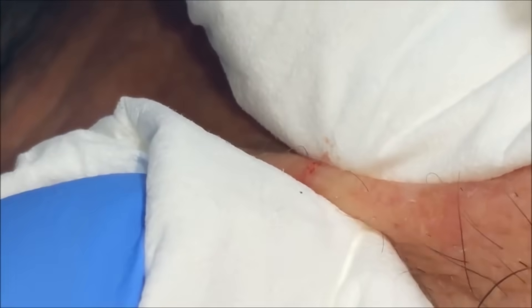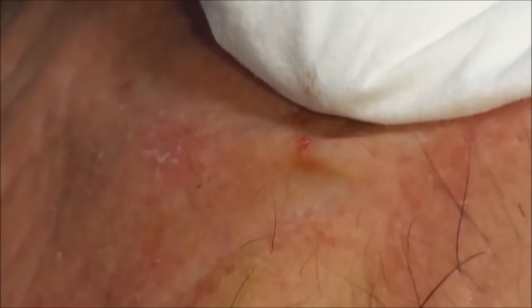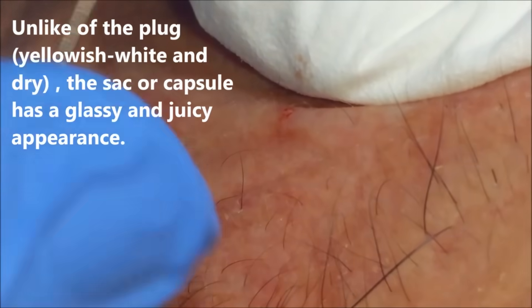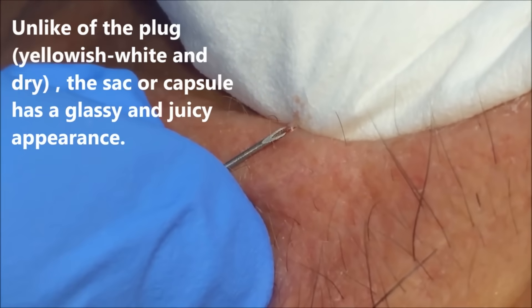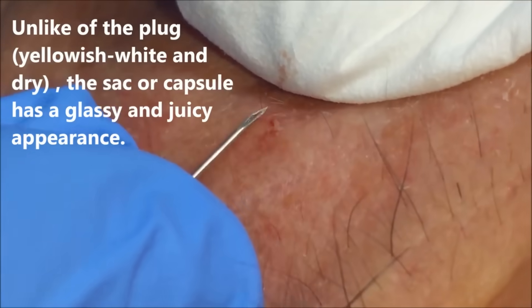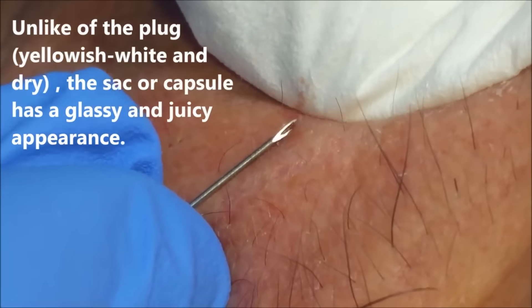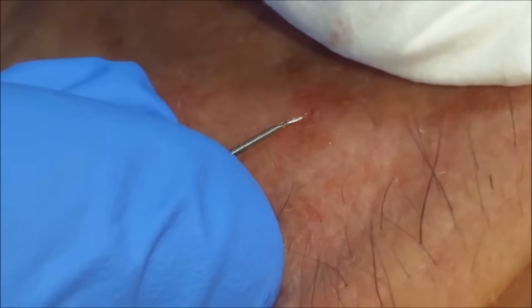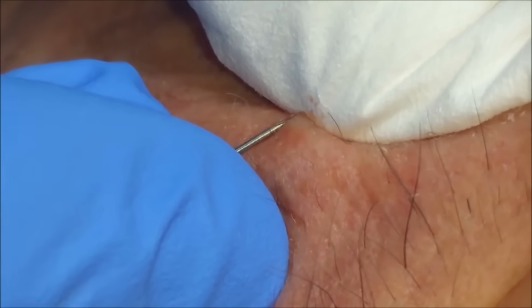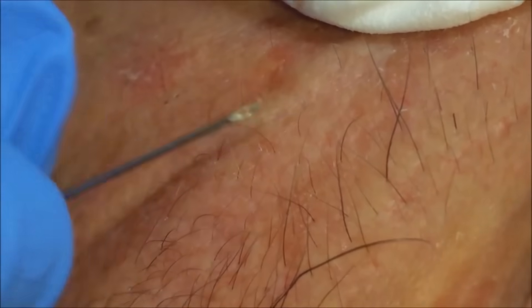The gold standard for treating pore of Winers is actually a punch excision if it's small, or an elliptical excision. You can see her loosening it up with just a simple needle — a simple 20-cent needle you can buy from a pharmacist. She's just loosening it up, opening the pore, extracting the contents bit by bit — not even using a curette, just a simple needle.